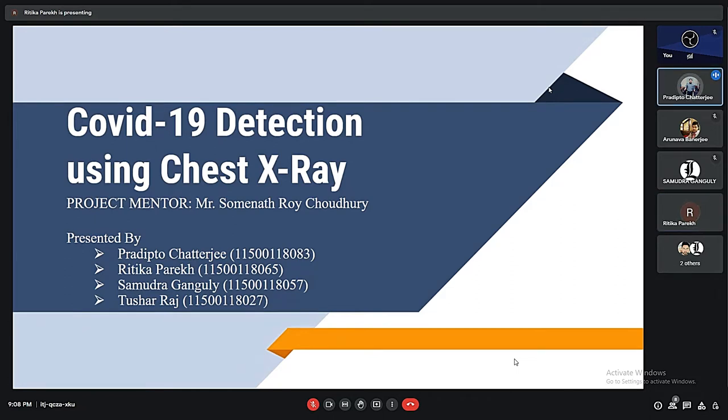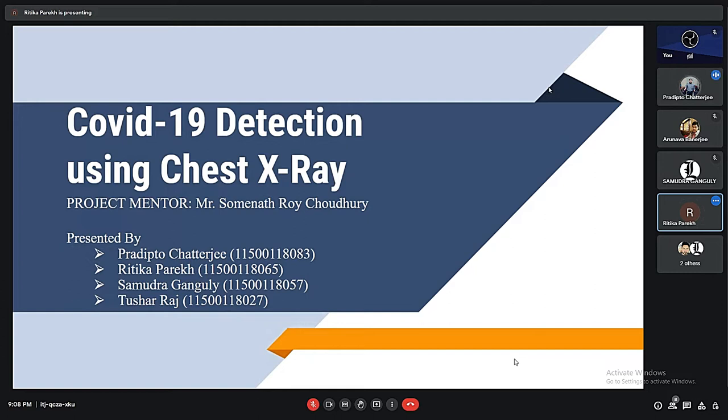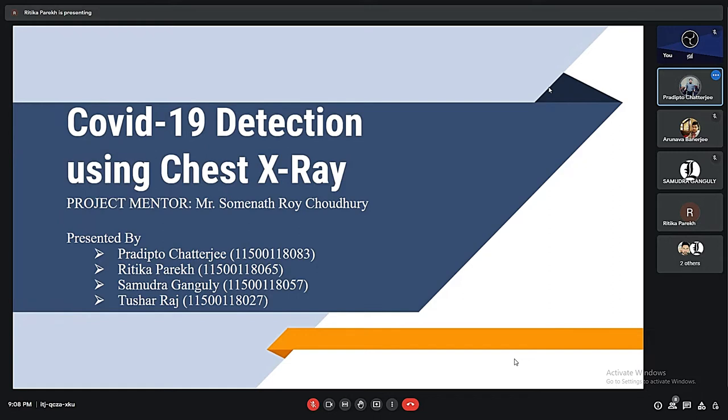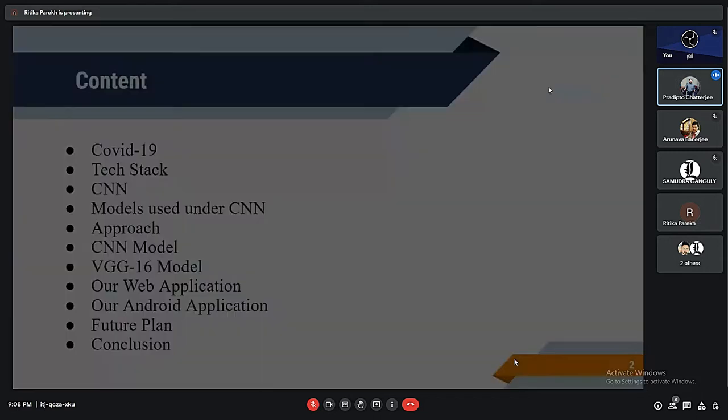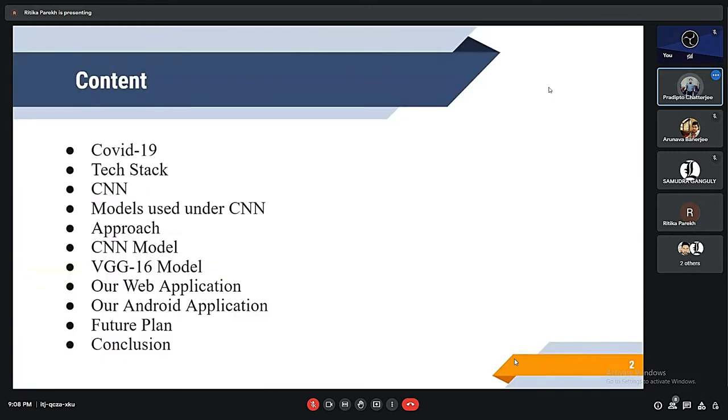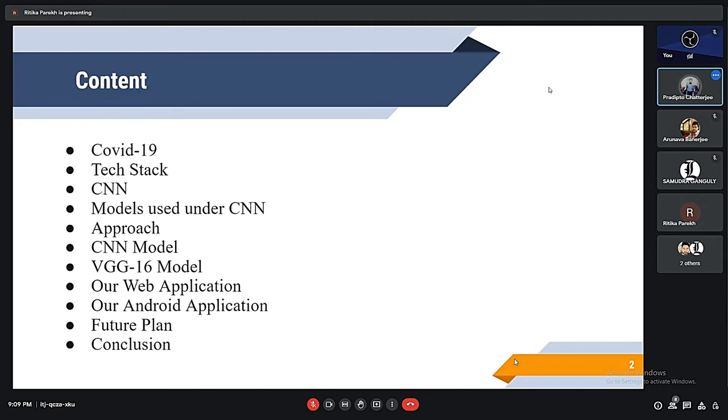The chest X-ray will be provided to the model and the algorithm will then decide using CNN approach and also we have used the VGG model to see whether a person is having COVID or not.